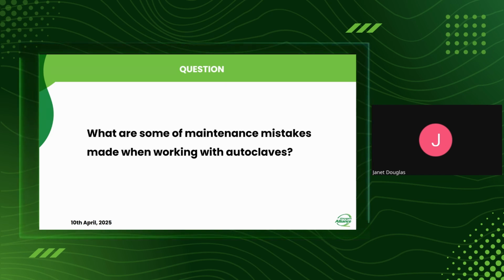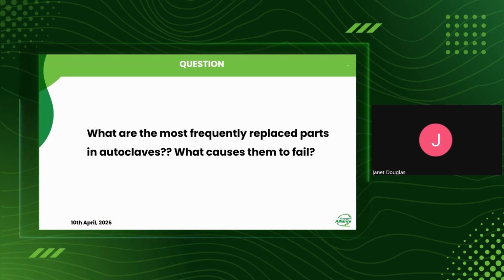And I've seen a response from Engineer Remy to say, Lovemore, you should check the pressure sensor, depending on the nature of the sensor being used, for scaling or complete blockage, and set the value of the pressure to be attained for it to go to the next phase. In some circumstances, the spring strain gets reduced over time, in which it fails to respond linearly to the active situation inside the chamber, in which case you are forced to change the whole sensor compartment. So that was a question that Lovemore posed in the chat, and Engineer Remy, thank you for answering that question.